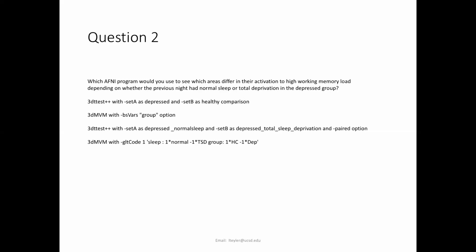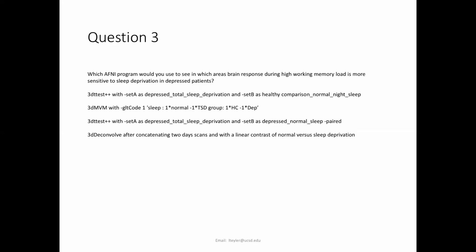Day after, right? Okay. And then question 3, which AFNI program would you use to see in which area brain response during high working memory load is more sensitive to sleep deprivation in depressed patients than healthy comparison?